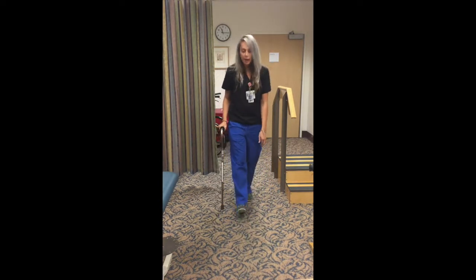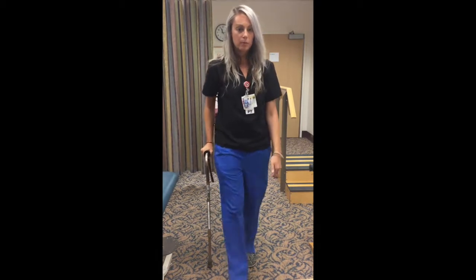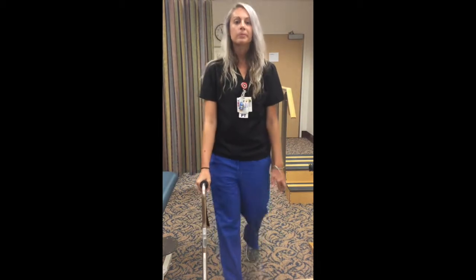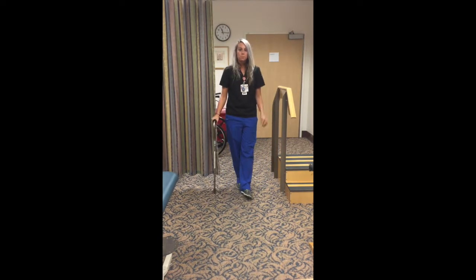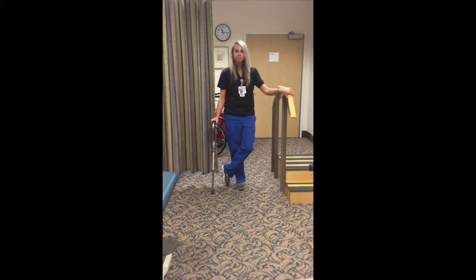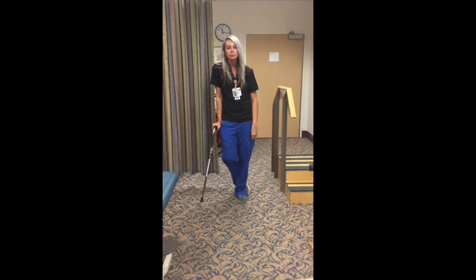So, and then after that, once you get the hang of it, you should be able to just walk normally with the cane. Yeah, and I know this is all very mechanically detailed, but I've seen a lot of patients transition from the 3-point gait to that more normal gait within 15 minutes of instruction. Oh yeah, sometimes I don't even have to coach them, they just do it automatically. But they shouldn't skip over that step, but sometimes people won't need more than 5 to 10 minutes of training through that step. Right. That's great.